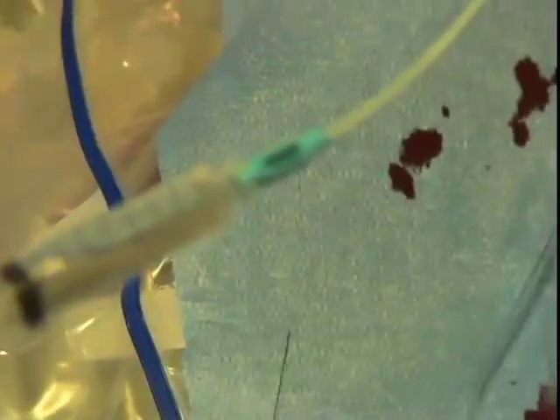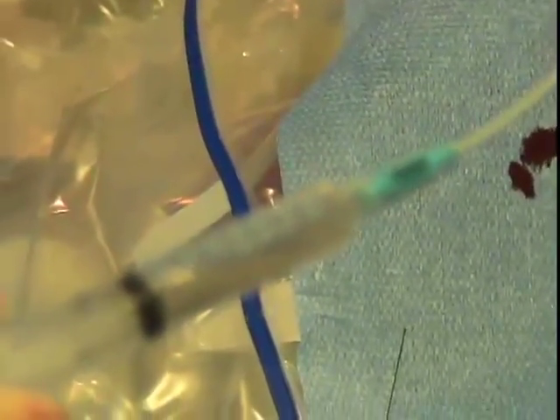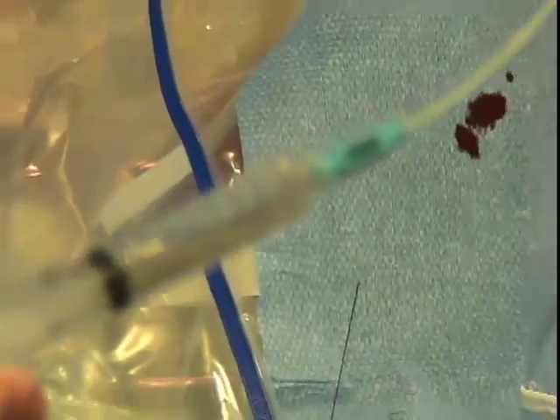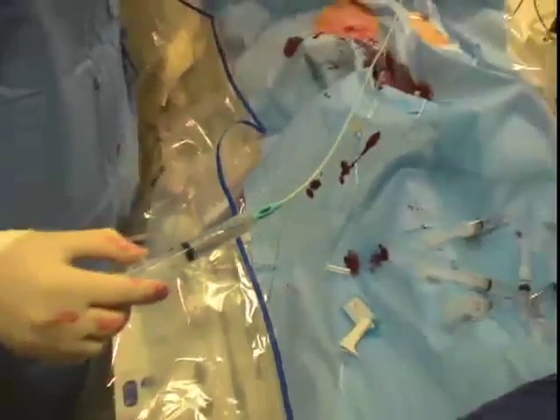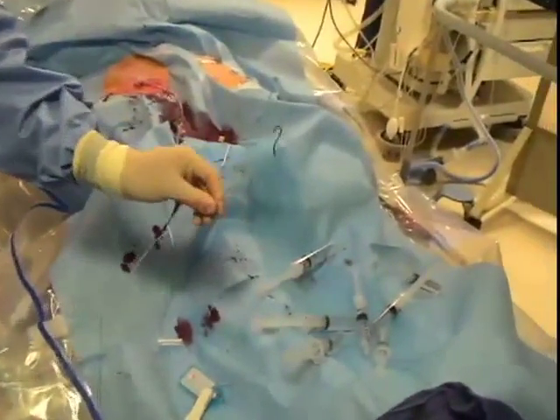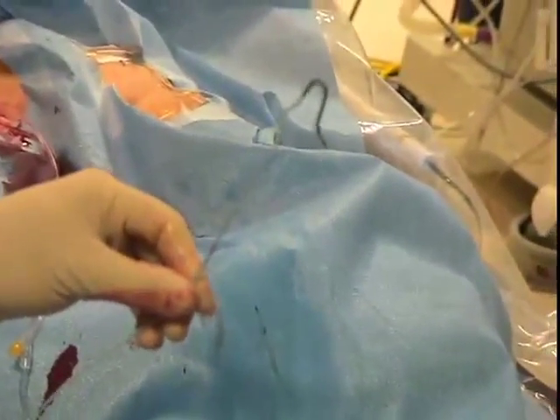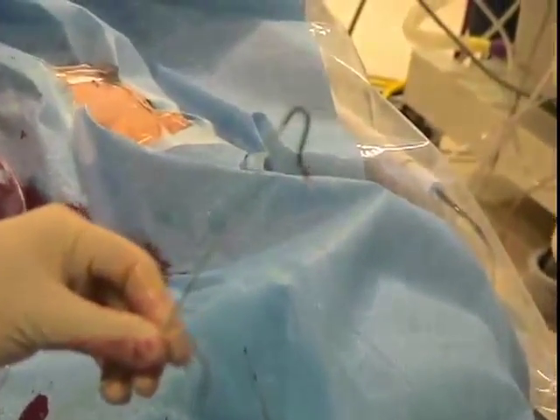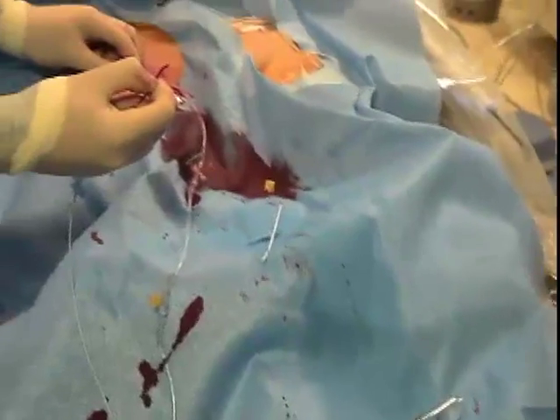Here's a syringe attached to the end of the catheter. Using the syringe, we can inject contrast, which then comes out the tip of the catheter. This contrast goes into the blood vessels, and the contrast is imaged.